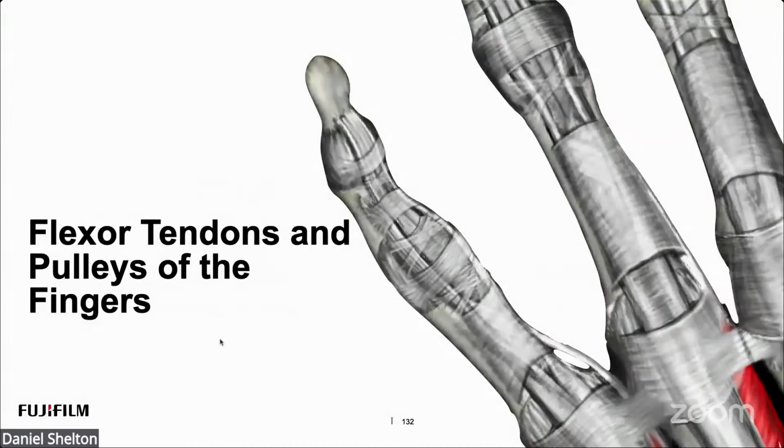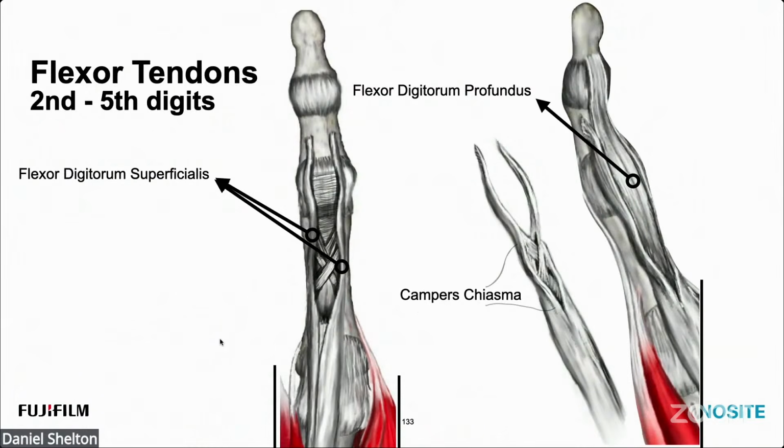Now we've got the flexor tendons and the pulleys of the fingers. It's a very exciting and dynamic part of the hand exam, but also very complex and complicated. Let's talk about the deeper layers. I'm assuming that you studied the palmar or the volar hand webinar. So I want to go over this relationship.